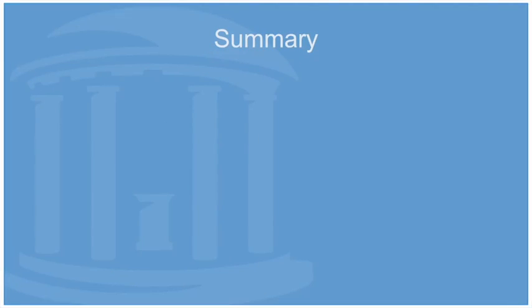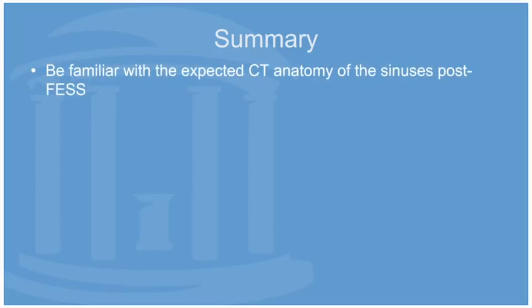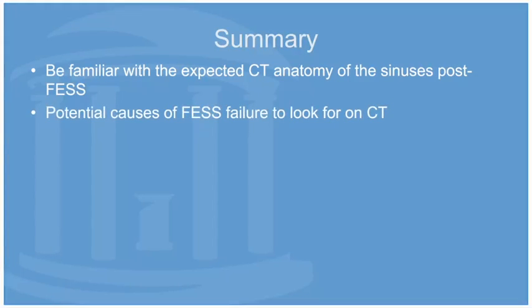So let's wrap up with a summary of what we covered over the last 20 or so minutes. We started with an overview of the steps involved in FESS procedures, and I hope that you will all have a good idea now of what the desired outcome should look like on a postoperative CT. We covered some of the more common causes of FESS failure that we may encounter on imaging.